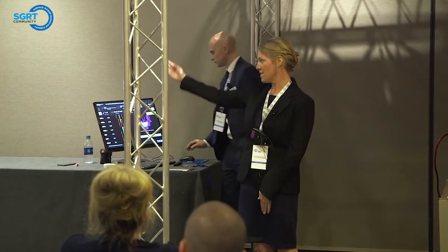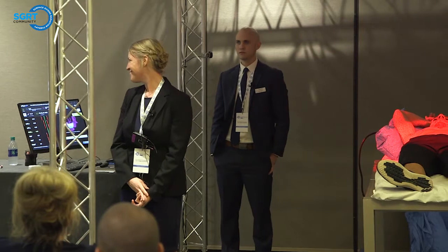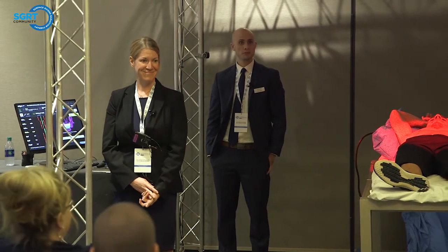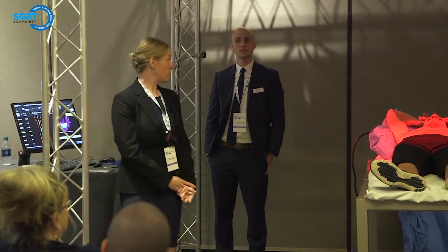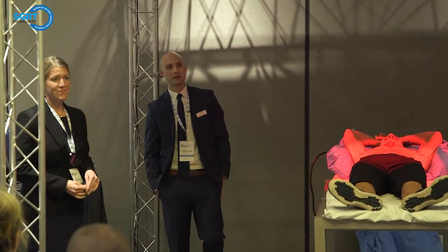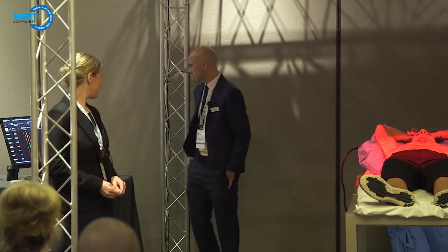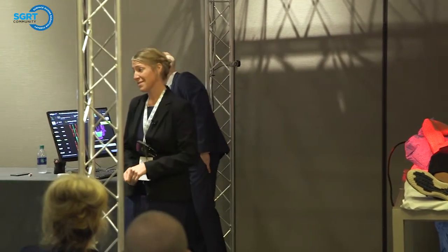You can see the verts are equal on both sides. It's not just on one side of the line. That will again be the visual feedback. Yes, we are going to be demonstrating that with our DIBH. That'll be coming up. All right, let's move on. Bolus.